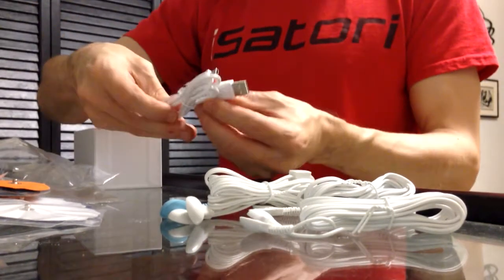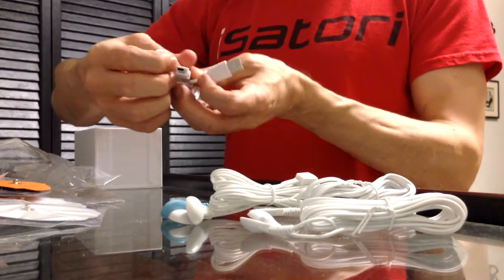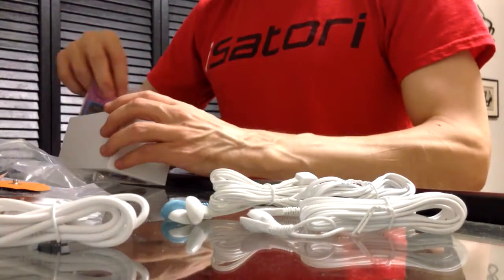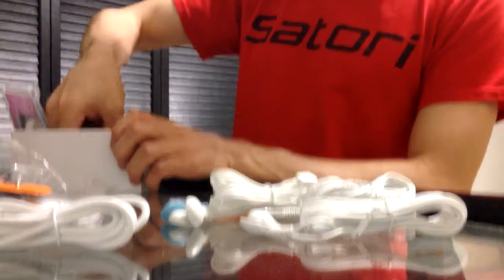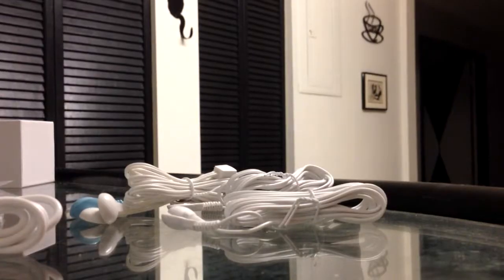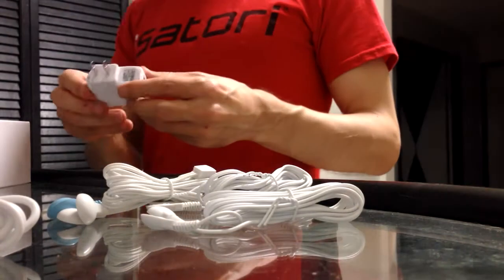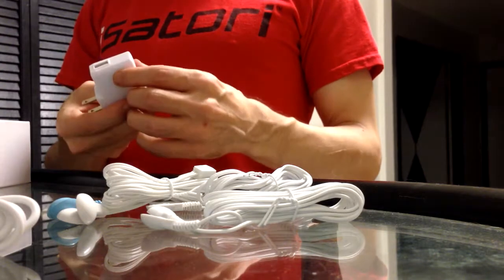And then here is the charging unit. It looks basically like a Kindle, and that's how you charge Kindles. So this also charges the units through the wall socket, so you have multiple choices to charge it, which is good.